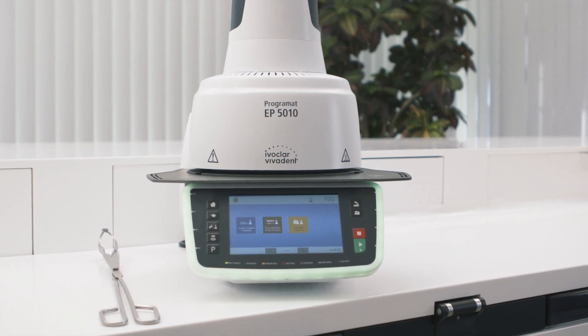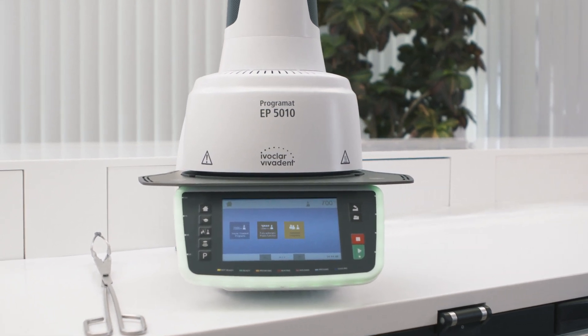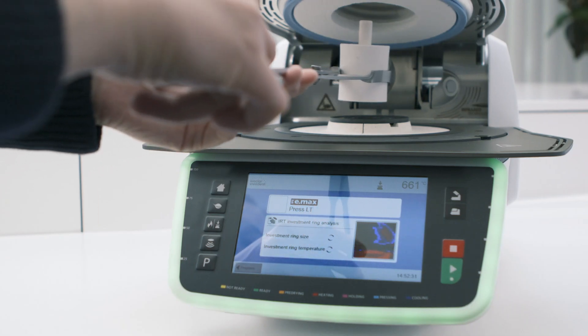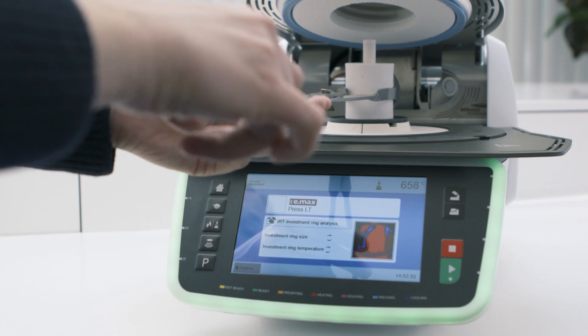If you don't want to use the FPF function, you have the option to run a conventional press process. The IRT technology comes in handy here too.